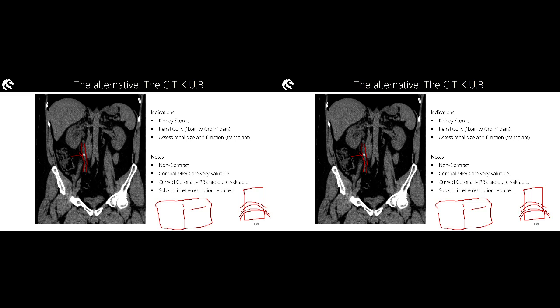So instead, why would you not, for example, CT their entire head and then do some curved coronals that followed the line of the mandible? If you were to do something like that, those curved coronals following the line of the mandible would create a digital OPG. Does that make sense?